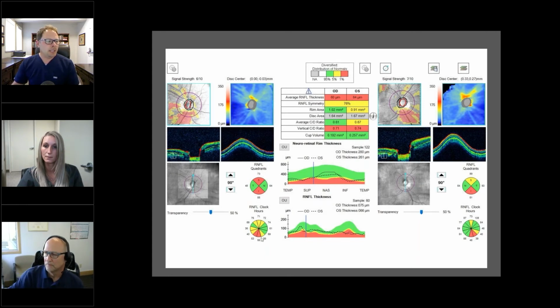Yep. So when the patient came back for the OCT a month later or so, it's kind of what you'd expect to see. So kind of pointing to those same areas up and down.